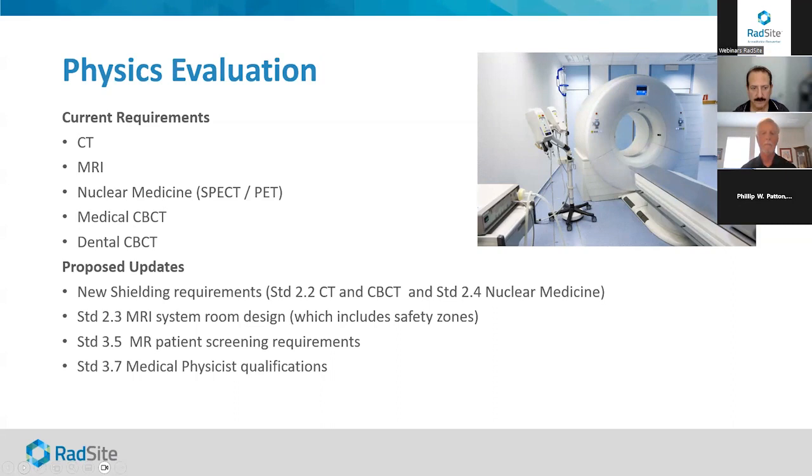For nuclear medicine, QC has probably been going on the longest of the modalities. From the nature of having a RAM license, you have to have certain types of QC completed. So for nuclear medicine, we're looking at uniformity. Obviously, we're looking at resolution. For a SPECT acquisition, we're looking to make sure that the image quality is what it should be. Are we getting the right resolution there?